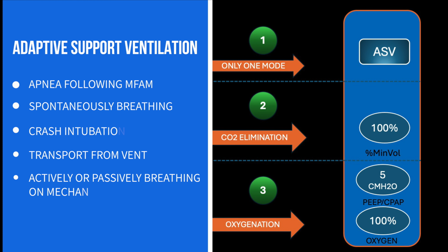Adaptive support ventilation is the mode we'll utilize for all patients intubated in the field following medication-facilitated airway management and spontaneously breathing patients after crash intubation or for transport out of a facility with patients on mechanical ventilators.